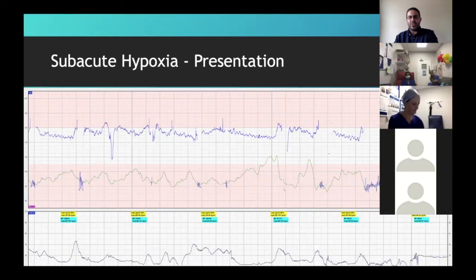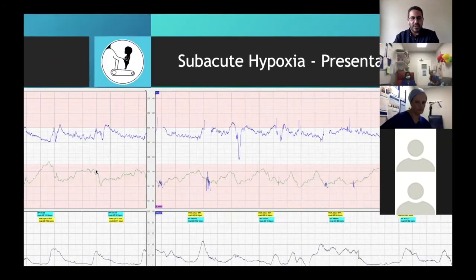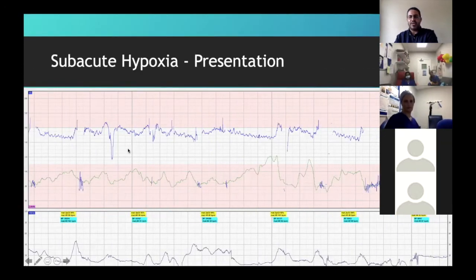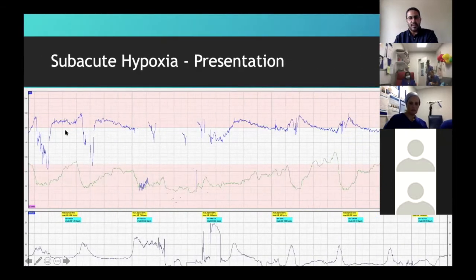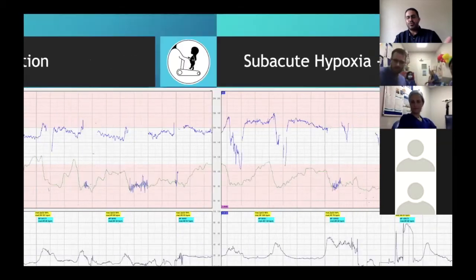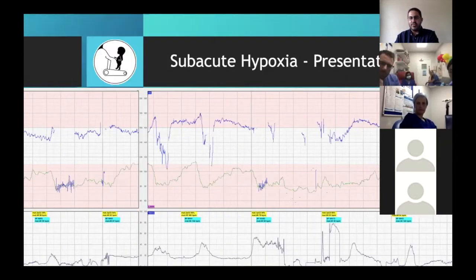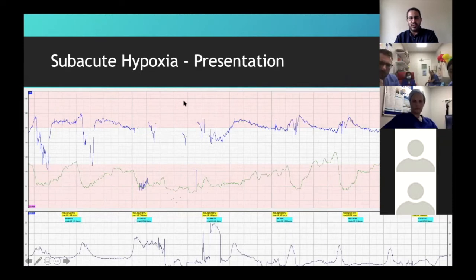Within the next 20 minutes, you can see the baseline started off here at 140, 135. Literally within the half an hour that they are calling, can you see where the baseline's gone? Can you see that? Yeah. That's all within half an hour, literally just because of those partial cord compressions that we were not paying attention to. They were significant. All she had was a terbutaline round about here. And you can see by the end of the trace that the baseline is literally just coming back down again. Can you see that? Yeah.